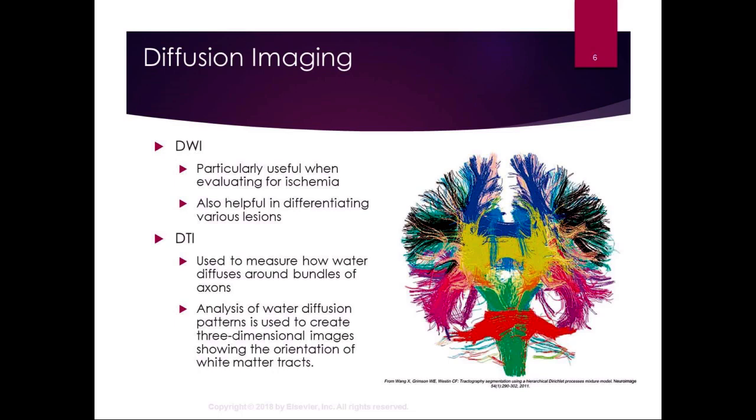And so in this picture, also I just think they're beautiful. That's the other thing. But in this picture, when I look at it, just not knowing all that much about it and not knowing how to analyze something like this, the things that I see are that red at the bottom, those are the cerebral peduncles. That's the white matter that's going from the pons to the cerebellum, or the cerebellar peduncles.